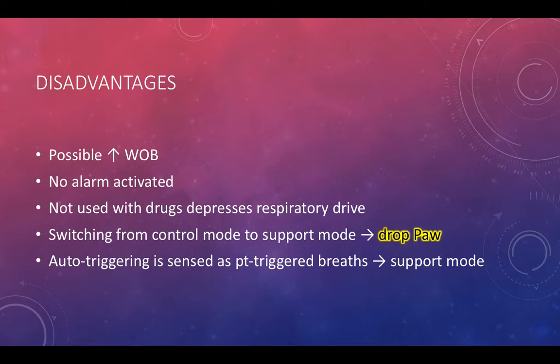Auto-triggering could be sensed as patient-triggered breaths, causing a switch to the support mode.